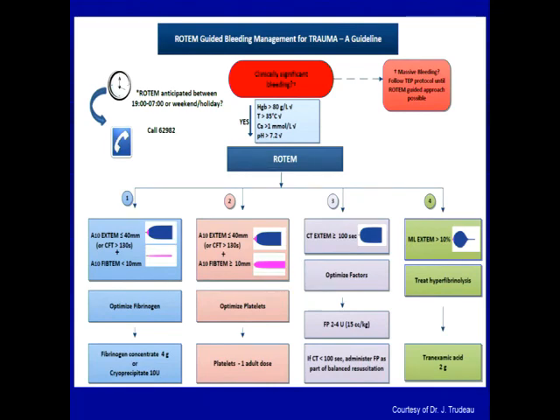Certainly in the trauma end of things, I talked to the ROTEM rep, and he was saying that they have the cartridge now that runs all 4 tests at once. It would be a bigger discussion, as it would probably have to be housed in the lab instead of the trauma bay, with a remote monitor so that ICU and trauma could access it. So realistically, as Luke's saying, you're looking at at least 20, 25 minutes between samples by the time you draw a sample and see the results coming out. Yeah, I will talk about which values are validated, but there's more and more data about the A5 that's coming out that looks promising.